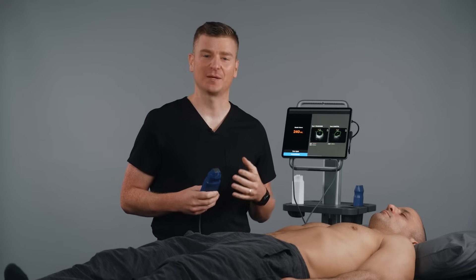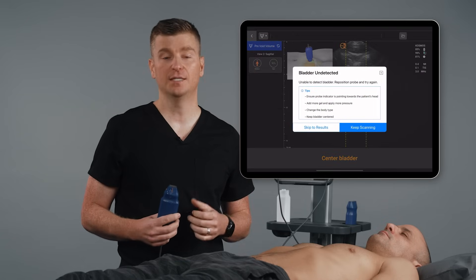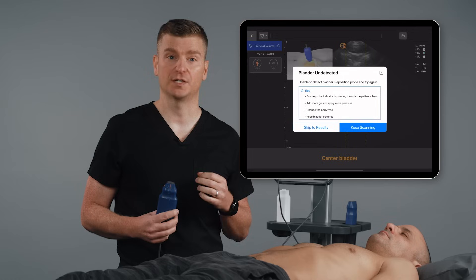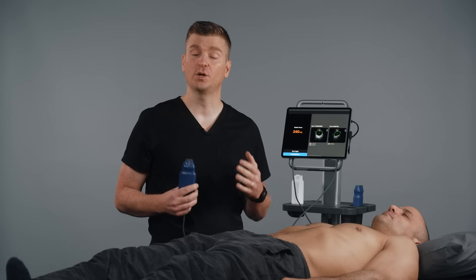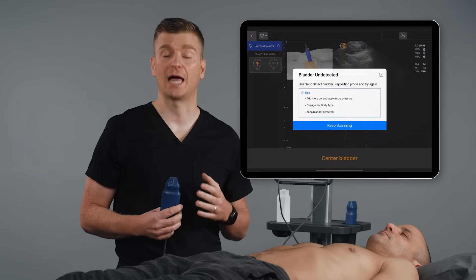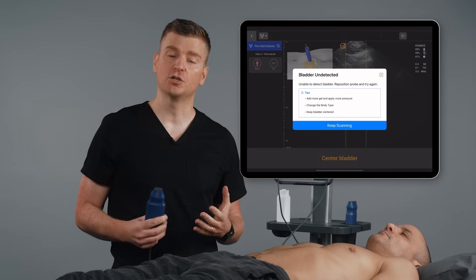Obtaining a sagittal view can sometimes be challenging, especially in extremely low bladder volume states. After 45 seconds of no bladder being detected on your screen, you will be prompted with the bladder undetected pop-up. This pop-up will remind you to make sure you are using correct positioning and also provide you with the option to skip to results. Cosmos Bladder will provide you with an estimated bladder volume based on the transverse reading alone. After 45 seconds of no bladder being detected in both the transverse and sagittal view, Cosmos Bladder will again prompt the user with the bladder undetected pop-up, which indicates that either the probe is not positioned correctly or the bladder volume is very low.